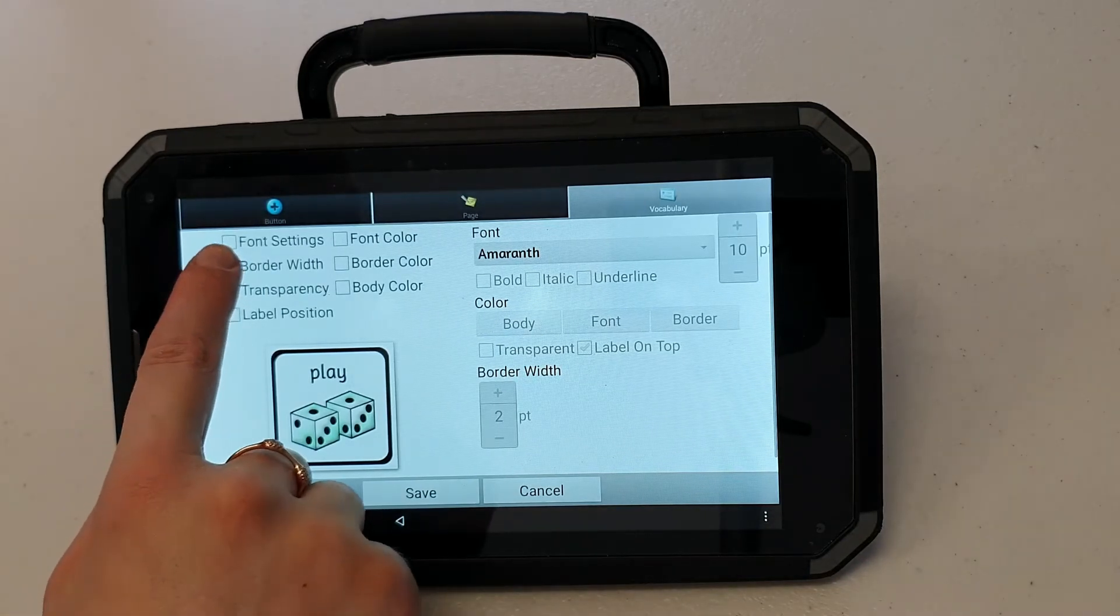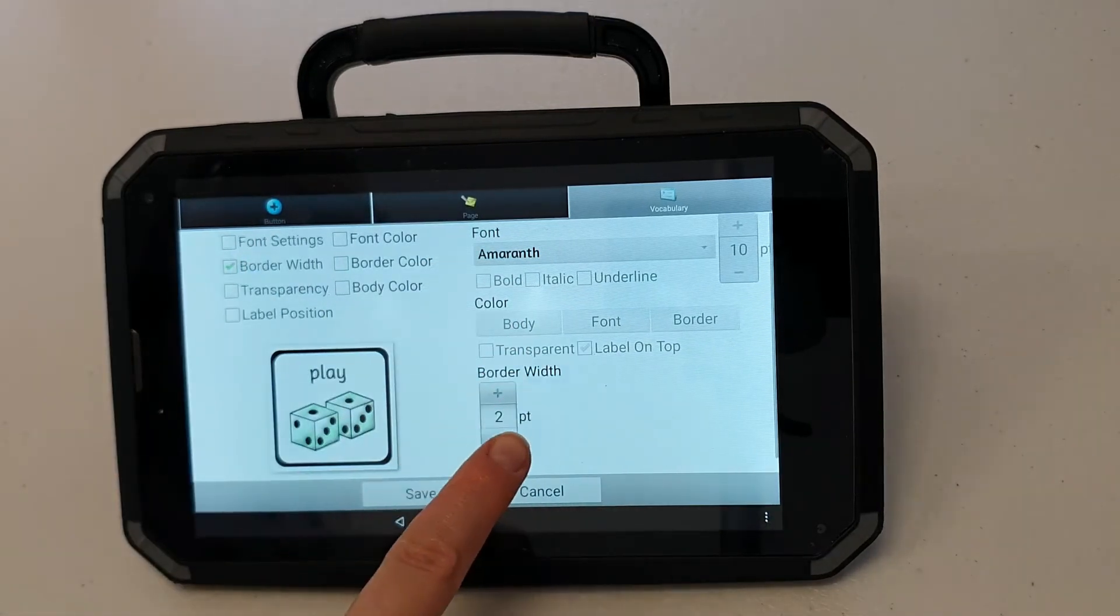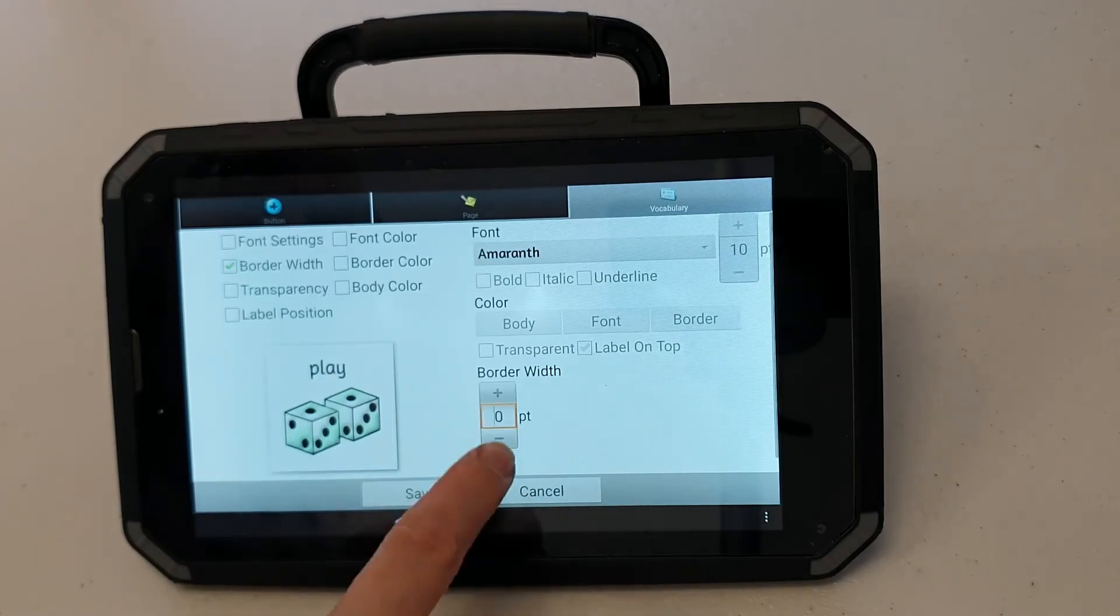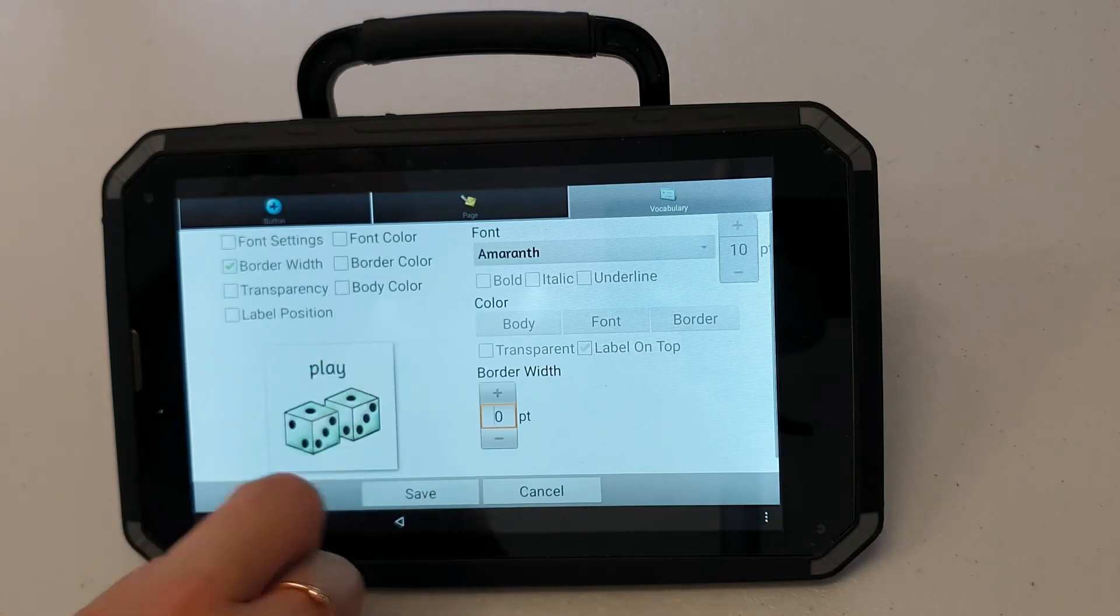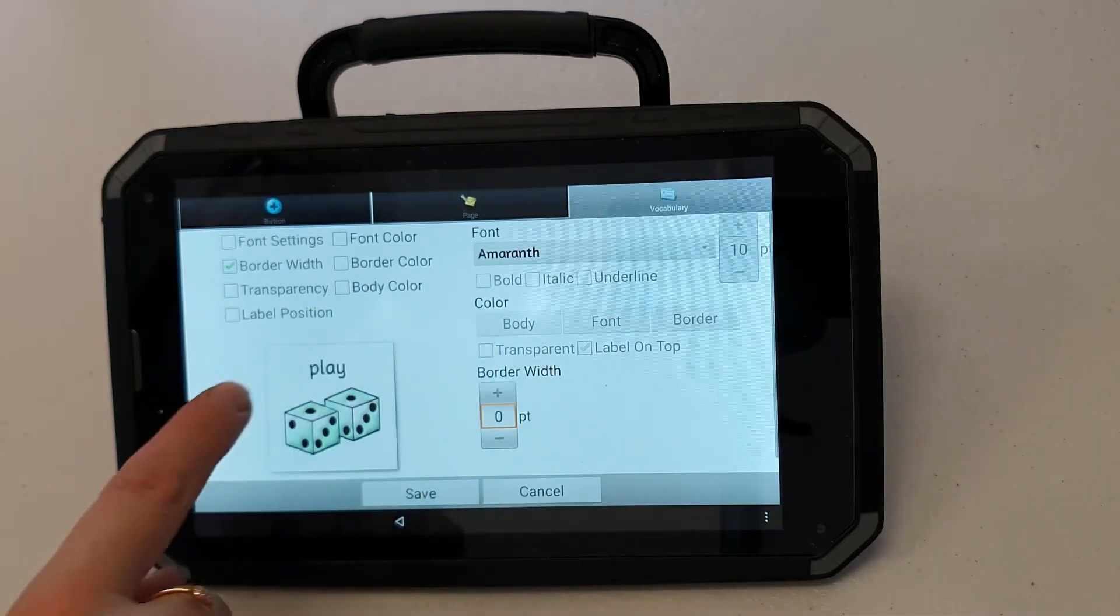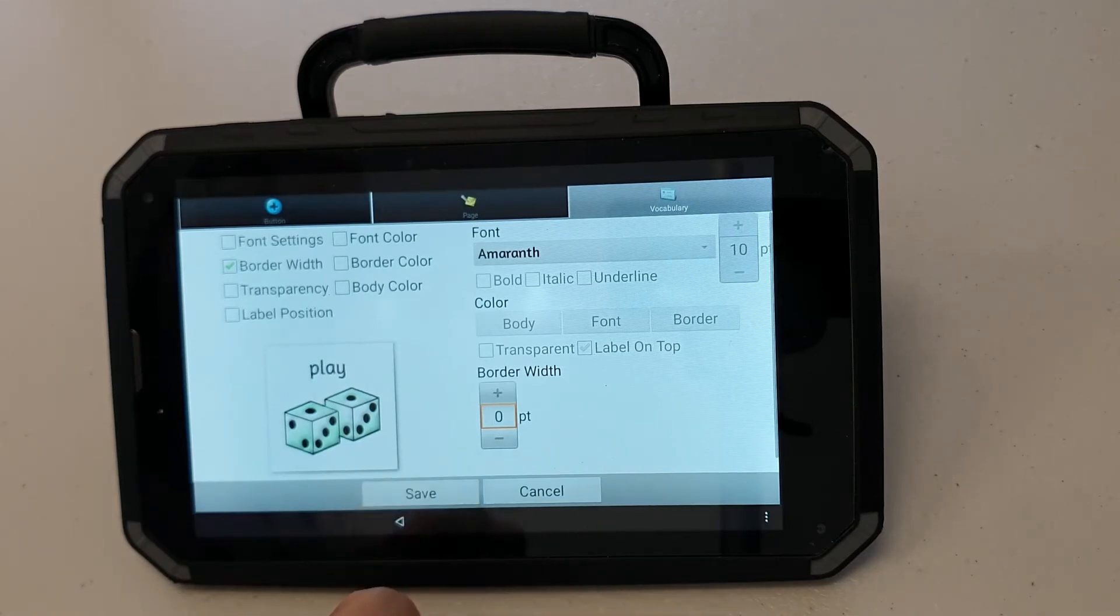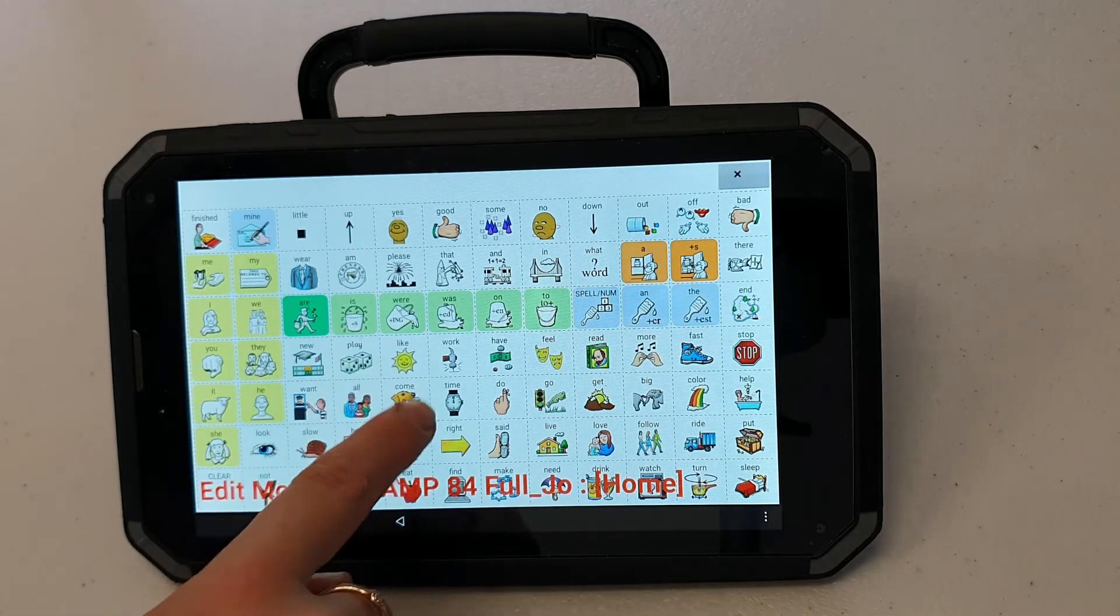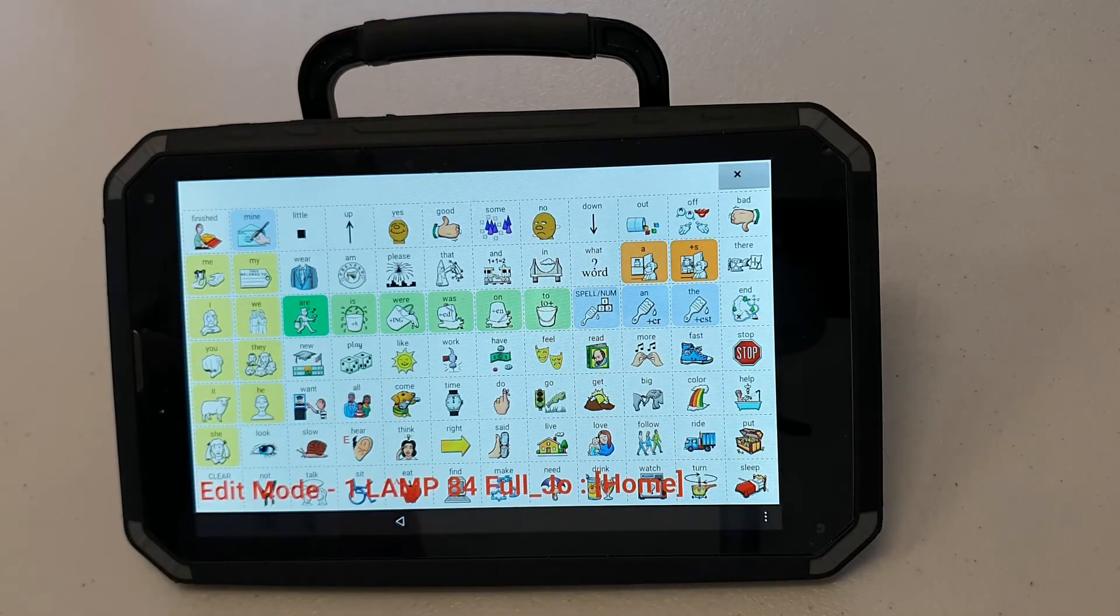I'm going to tick the border width because this is the setting that I'm changing and then press the minus button. Now I can see that the surface area of my button has become slightly larger because I've decreased the size of my border. I'll press save. And as you can see I don't have as much of a border around my buttons anymore.